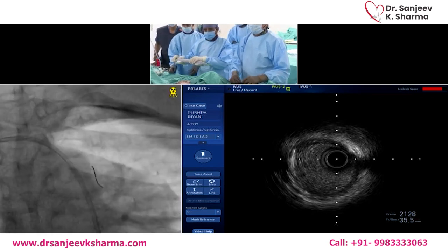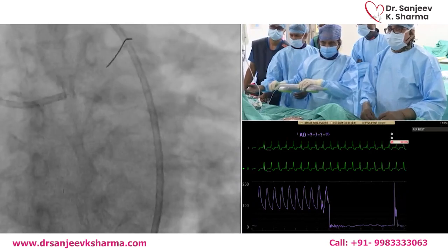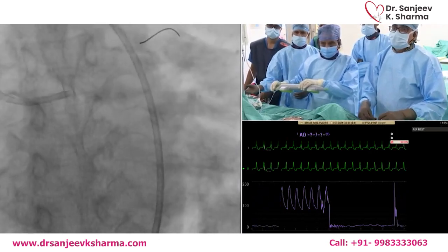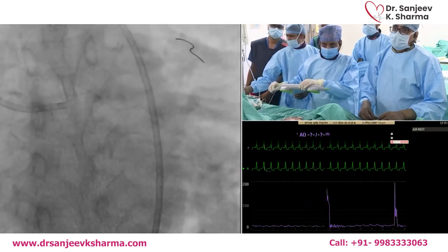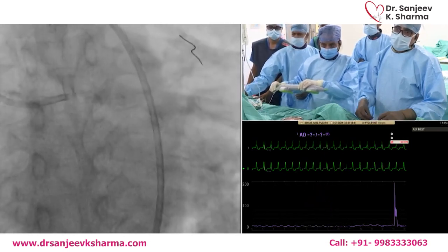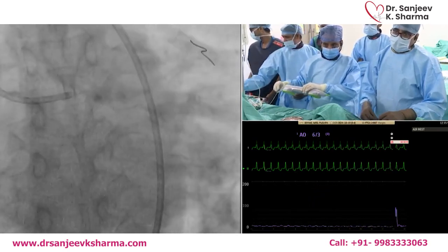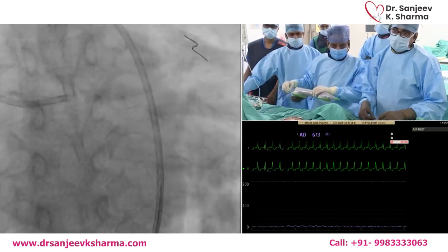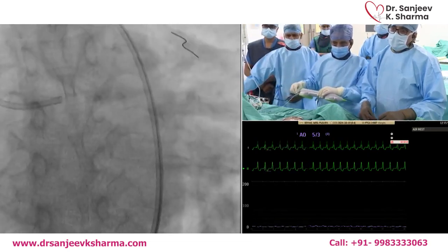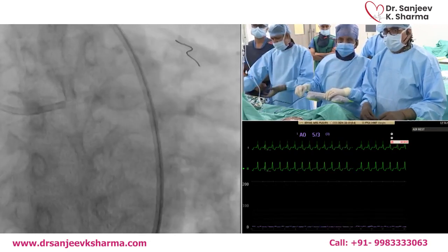Go ahead. Okay, all right, so it's orbital down the LAD, left main LAD, and high pressure balloon towards the circumflex based on the IVUS finding. There was not much calcium in the circumflex. That's right. What other calcium modification strategy does the panel like to discuss? Whether you want to go for IVL in such a case where stenosis is not that critical and you can easily go across with the balloon. This is one of the possible strategies one can argue.